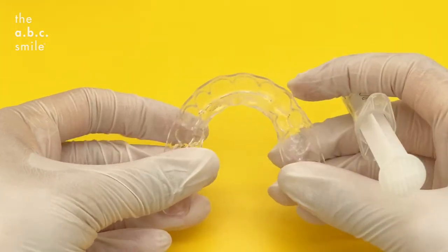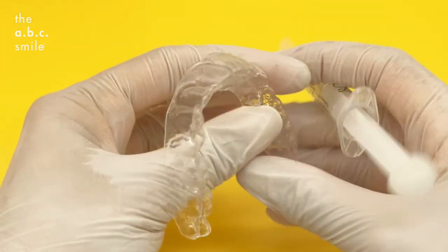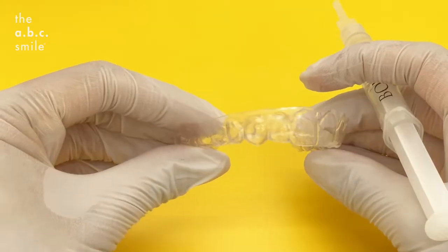This is your whitening tray, which may also be your retainer. Before your session of whitening, make sure you've brushed your teeth. Have a quick check to make sure your trays are also dry.